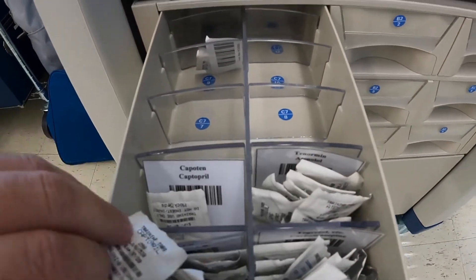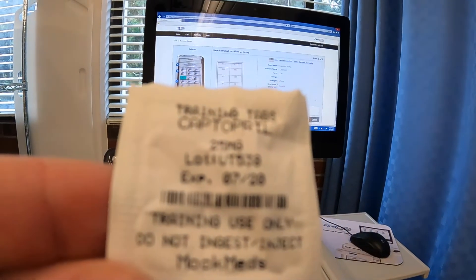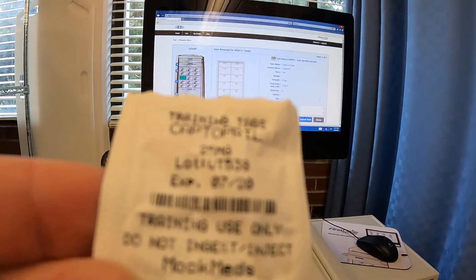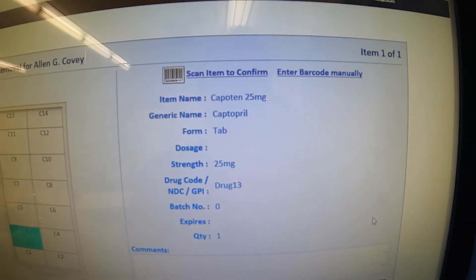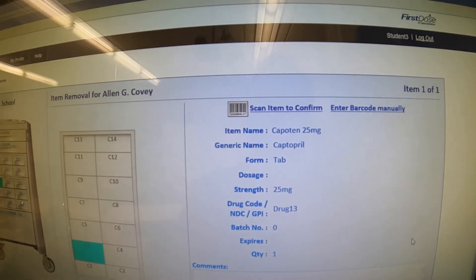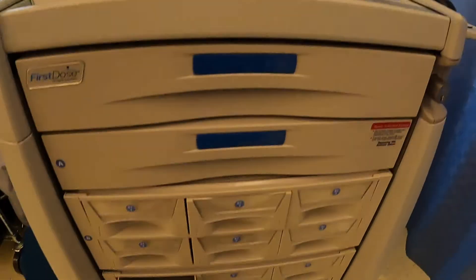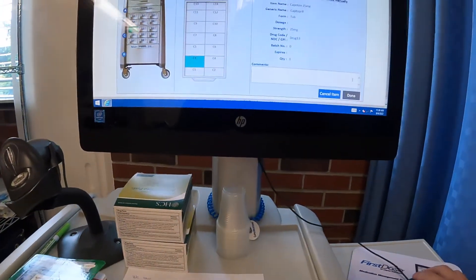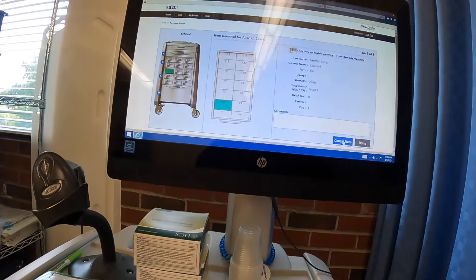So I'm going to go ahead and pull this open and take a quick look. It looks like it is Captopril 25 milligrams. I look at the expiration date, and then I'm going to come back to my order up here and verify that it's correct, and also verify with my paperwork that I've pulled the correct medication. Once I've done that, I'm going to go ahead and close the drawer. Then you go ahead and hit the done button, and you would be done with pulling that medication.